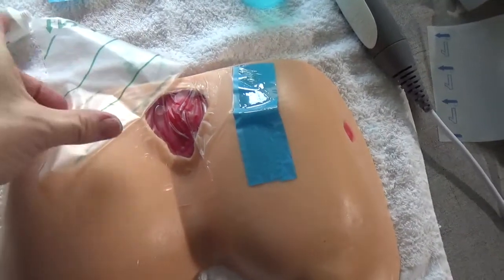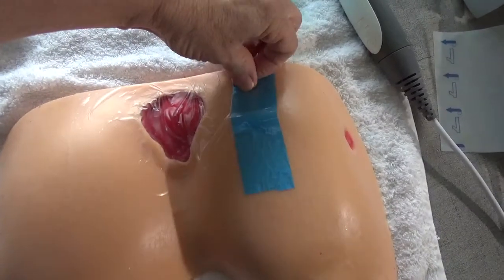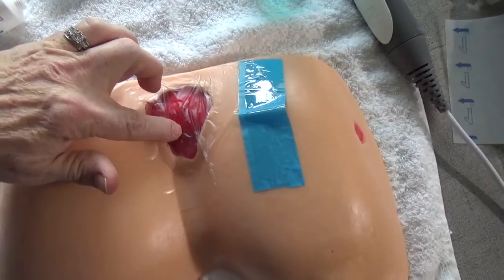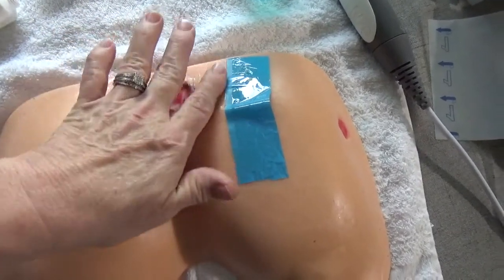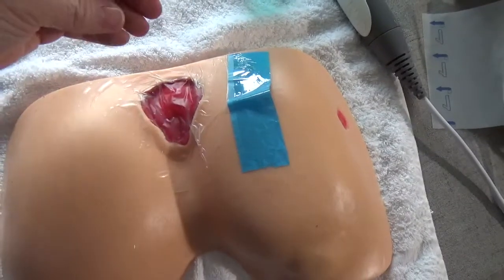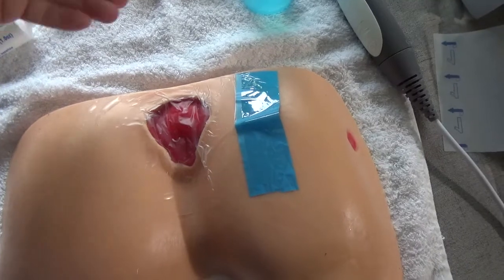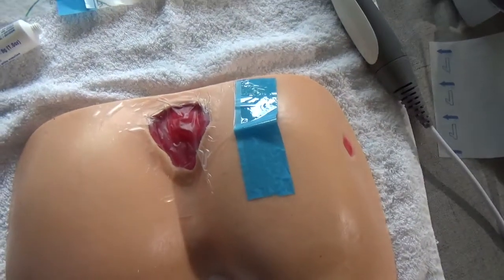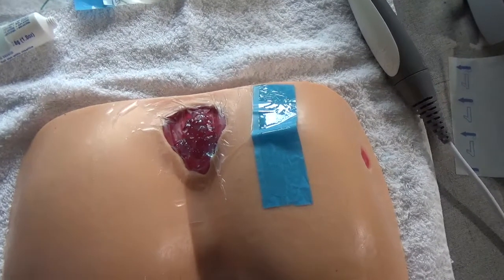just removing the outer layer there, and so what is left is the gel inside there touching the wound, and then this plastic layer that will keep the ultrasound unit from actually touching inside the wound. Now here's the trick. We can put our ultrasound gel on that clear film.